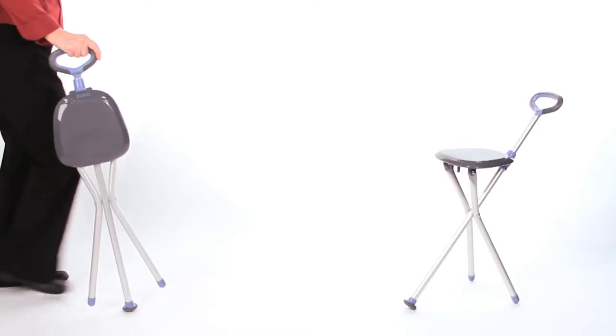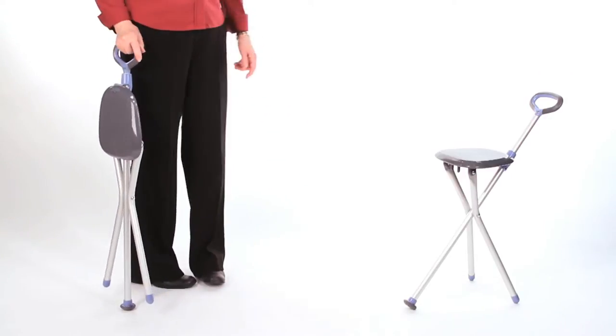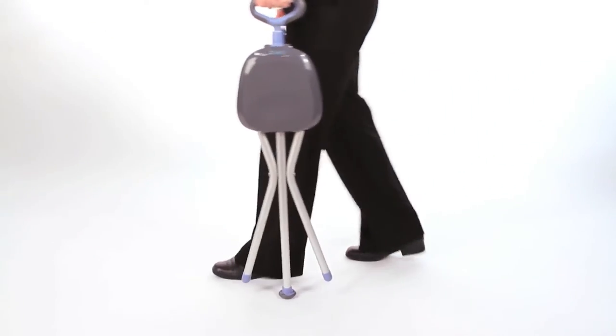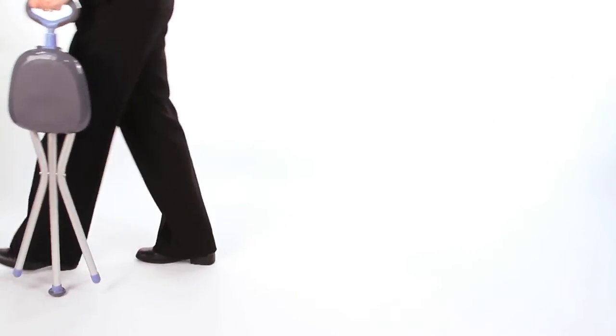The Juvo Travel Seat and Cane is a walking cane and seat in one. The cane is lightweight, contemporary in appearance, and has a soft rubberized comfort handle.